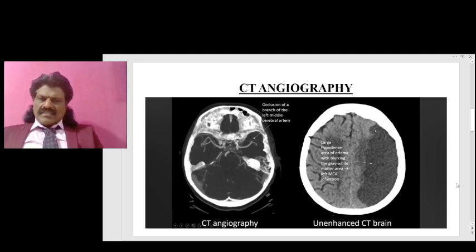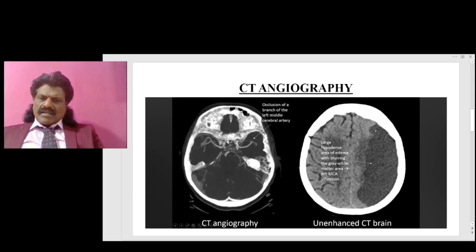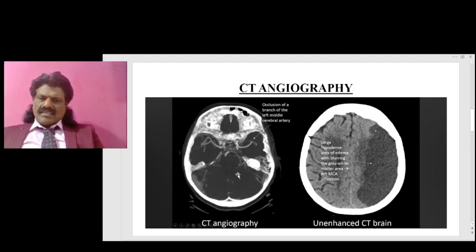Here you can see the MCA. On one side the MCA is well visualized — the main stem and its branches are clearly visible. But on the other side, the MCA is occluded; there is an occlusion of a branch of the MCA. This is the CT angiography image where contrast is given in the blood vessels, soft tissues are suppressed, and you can see the contrast-filled vessels.